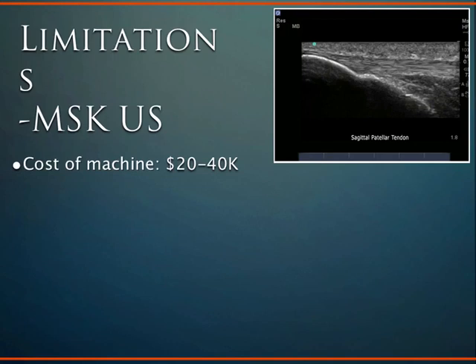In terms of limitations, though, it certainly can be expensive. These machines are not cheap, and if you're in a private practice, starting up a practice, or even an academic situation, there is a significant investment. So there's a lot of front-end cost, but in the end it can pay off in terms of accessibility for the patient, accuracy of diagnosis, and accuracy of procedures and injections. We'll talk a little bit more about that.